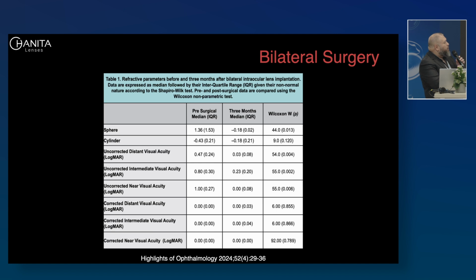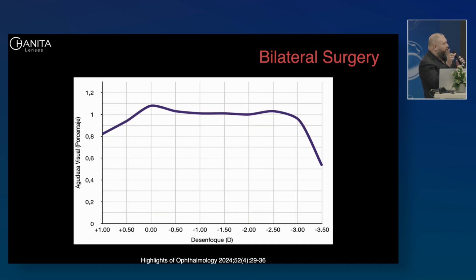This is our bilateral surgery focus curve. It is even better than the one proposed by the company, and that's something really interesting, because when we as surgeons see the focus curve given directly by the lab, I think we all tend to look at it with a pinch of salt. We don't know if it's totally true, but when we see it on our own patients and we see that it's actually better, it's a really good thing.